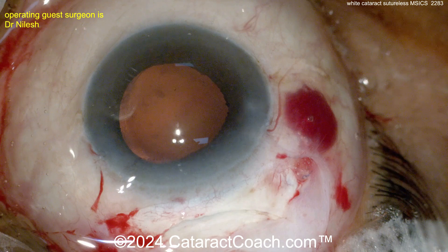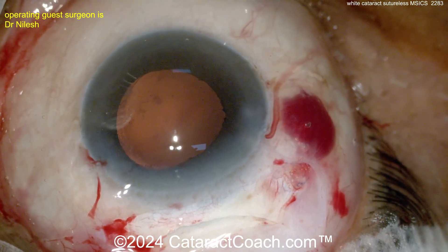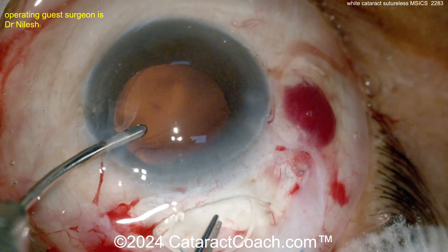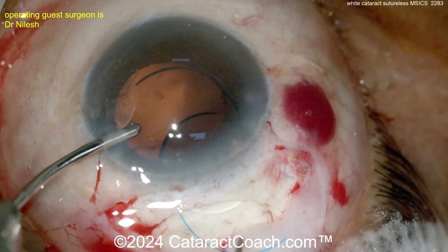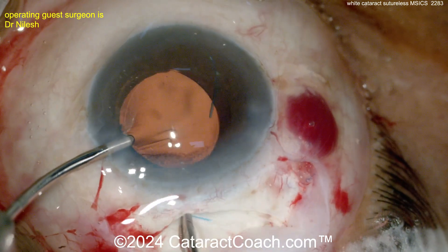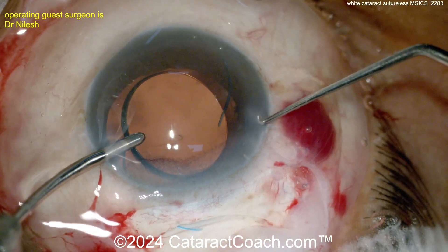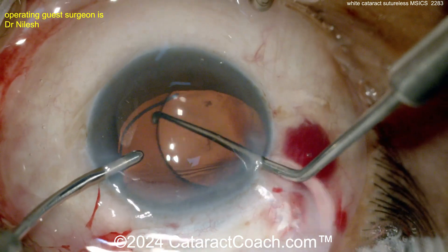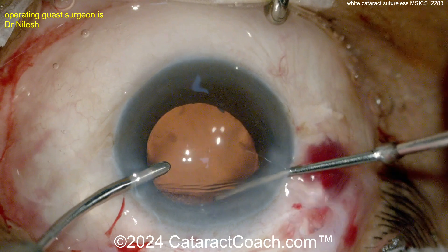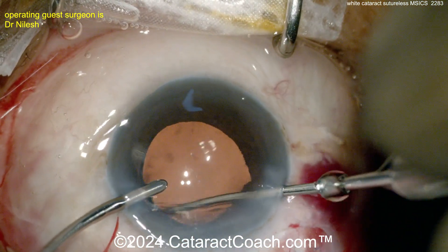Now we're going to do hydro-implantation — that simply means using the infusion of BSS through the side port to inflate the eye and inflate the capsular bag. There is the infusion, and here comes a three-piece lens going into the capsular bag. It's sitting on top of the iris initially, so using a Sinsky hook through the other side port to dial it into the bag — one haptic in, then rotate and get the other haptic in the bag as well. Beautiful case.